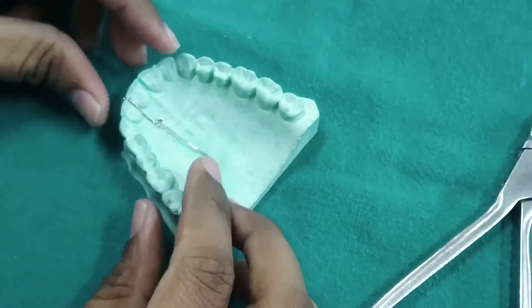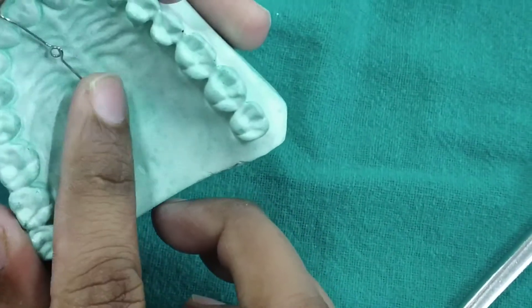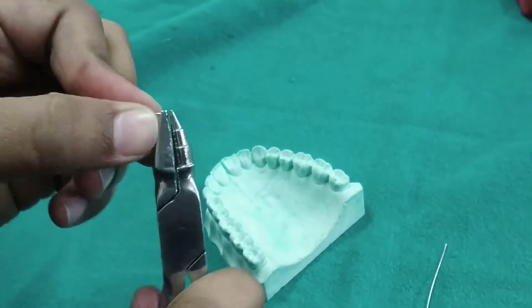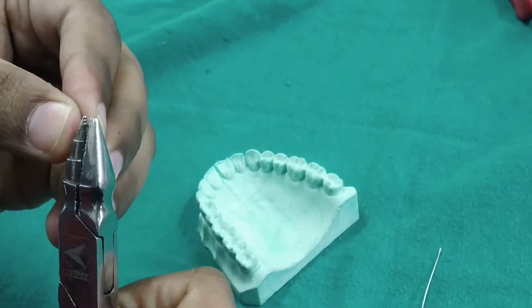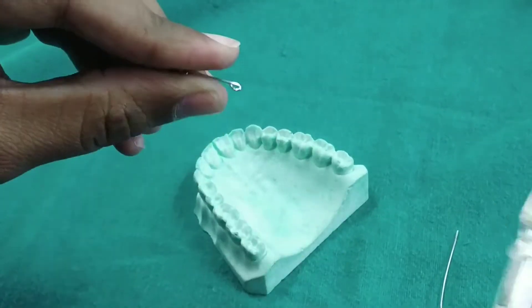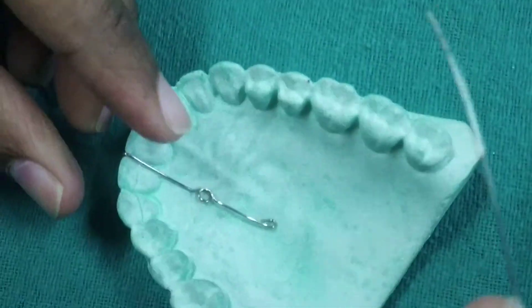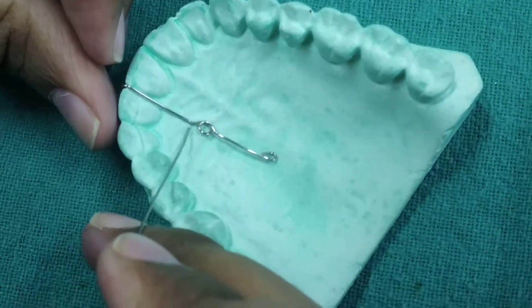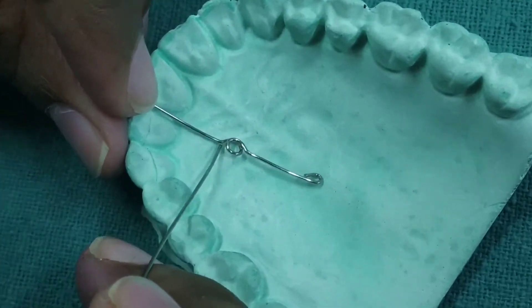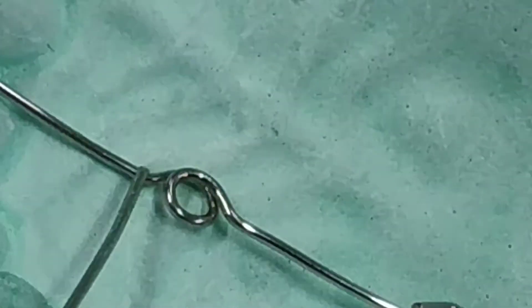Now the wire has been adapted to the palatal surface. After this we will give a retentive tag. Now the finger spring has been adapted to the palatal surface. As you can see, the retentive arm is away from the tissue and the active arm is towards the tissue surface.